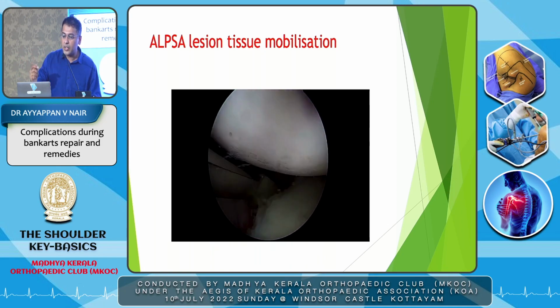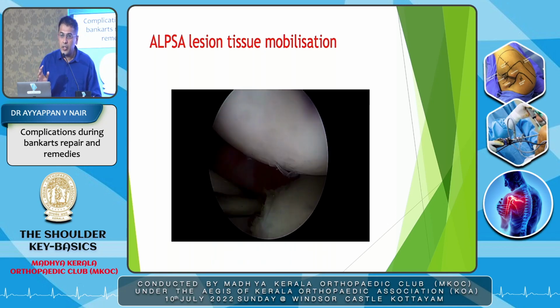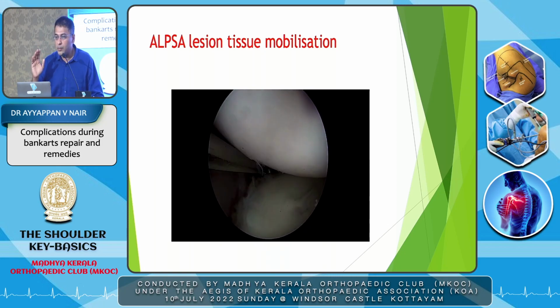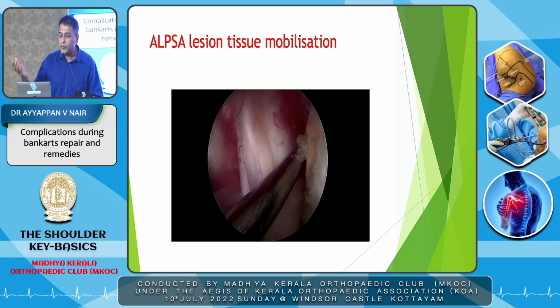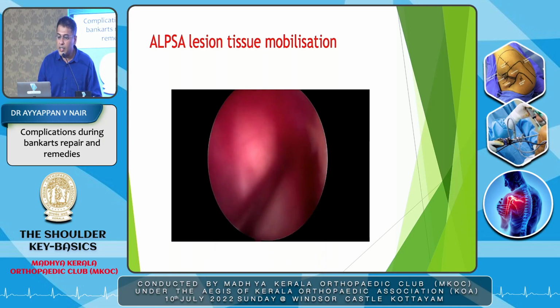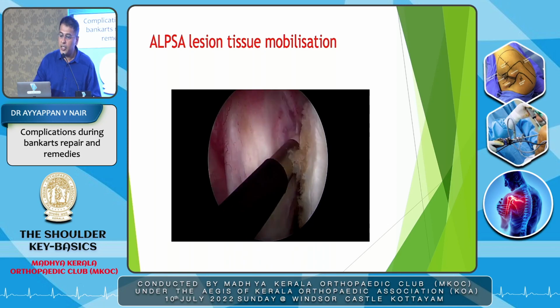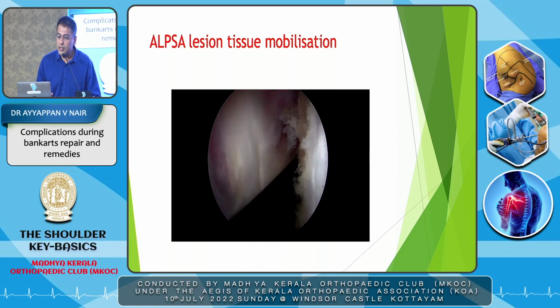You can use a ring curette, which can elevate it properly. A thin rim has to be elevated because soft tissue will not heal onto the cartilage. Soft tissue heals onto the bone. So you definitely have to do that elevation. And when that is done, you can see slowly I've elevated, in this particular case, all the way down, and the tissue is coming up.